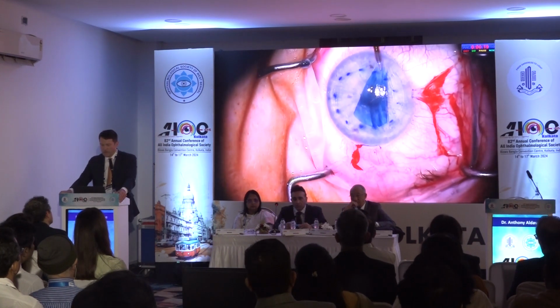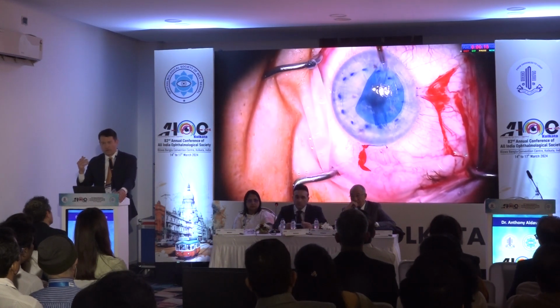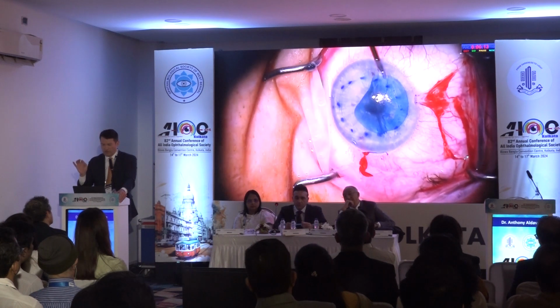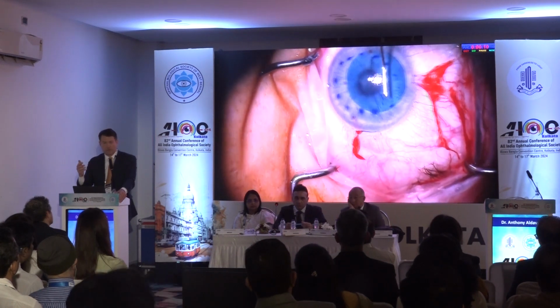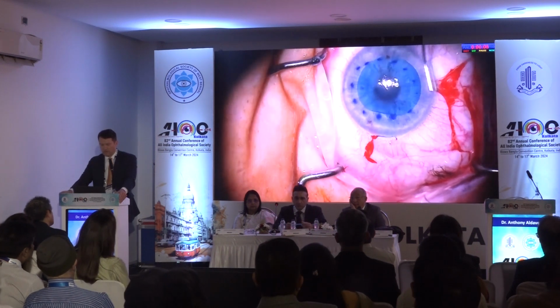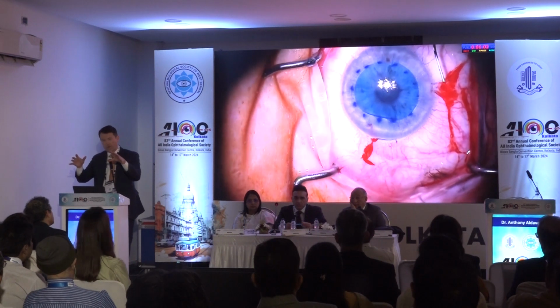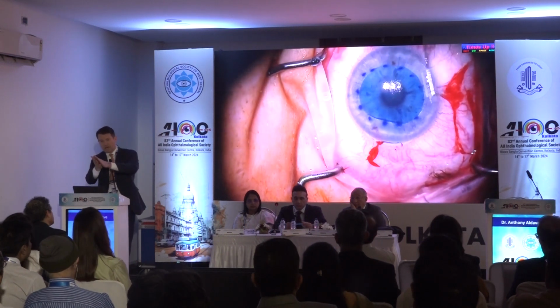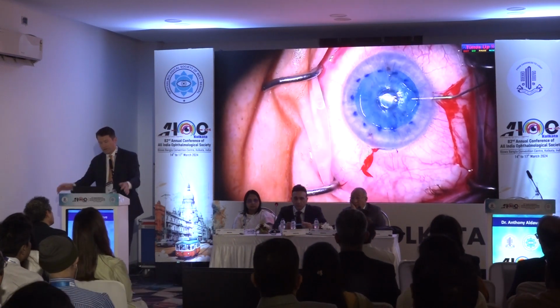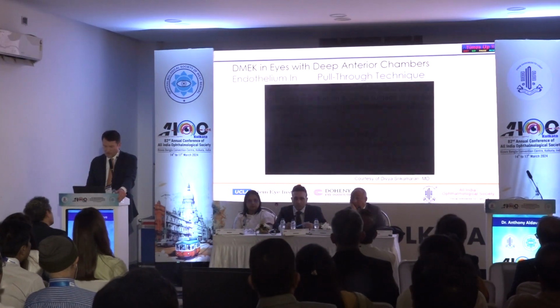So she's just holding on to it, and by either the assistant pushing on the plunger, or you can use a surgeon-controlled foot pedal to control the irrigation, the graft unfolds spontaneously. Once it's unfolded, then you just sort of tap it to move it in position. So in this case, it doesn't matter how deep the chamber is. It's unfolding because of the fluid flow along the forceps. You don't need the iris plane to unfold the graft. So this technique is really helpful for these deep anterior chambers.